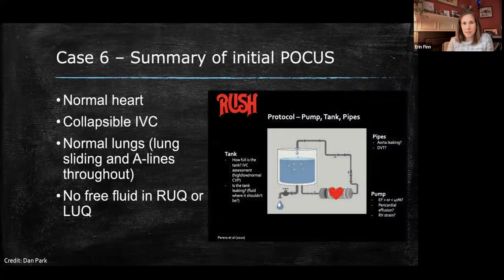And we don't have time to go through all of the RUSH protocol, but RUSH is rapid ultrasound in shock. And so you're going through your differential about different types of shock and trying to figure out what the most likely causes. And this is a POCUS protocol.